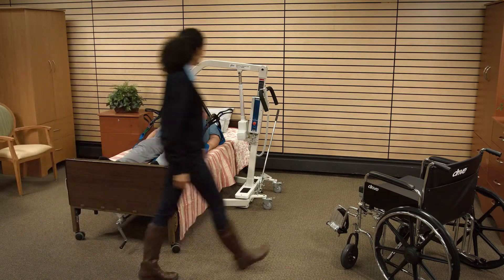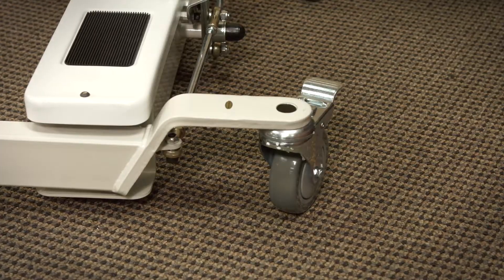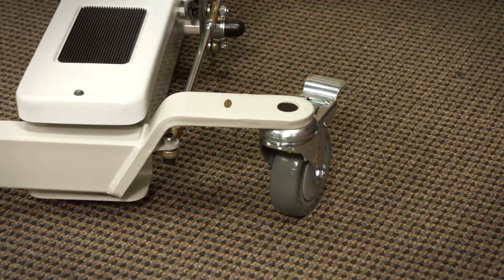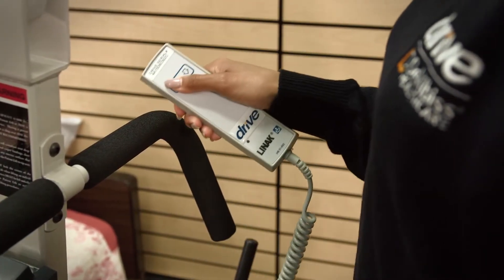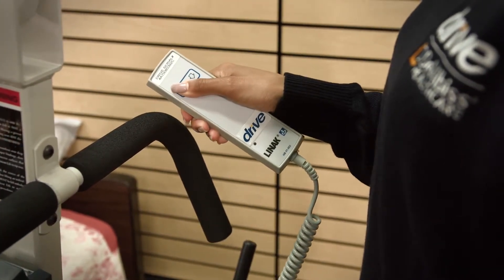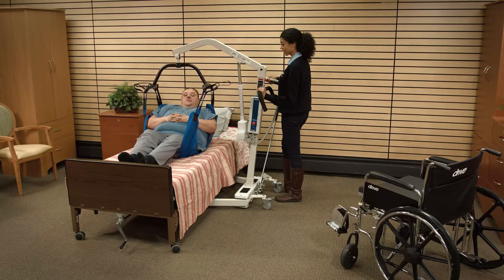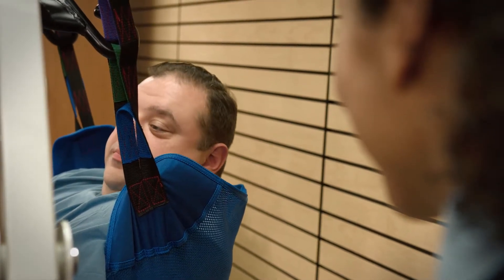Do not lock the casters of the patient lift when lifting an individual. Casters must be left unlocked to allow the patient lift to stabilize during lifting procedures. To lift the patient, press the up button on the control handset. Lift the patient until his or her feet will swing easily off the bed, ensuring that the patient is at all times facing the attendant.